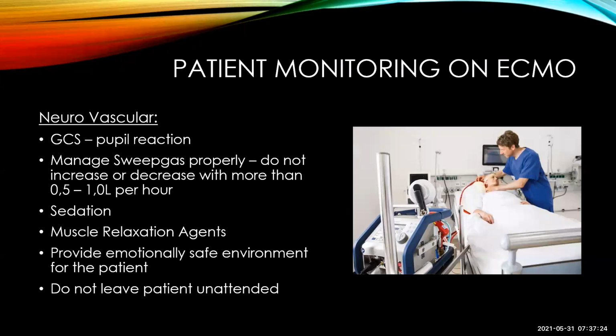And then this was also a good patient to come off ECMO, but now because we've had air in the circuit, we don't have a patient anymore. So as soon as you see that there's any changes there, report it, and then we can react accordingly.